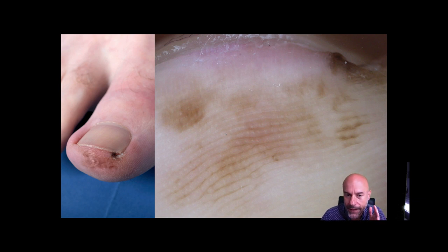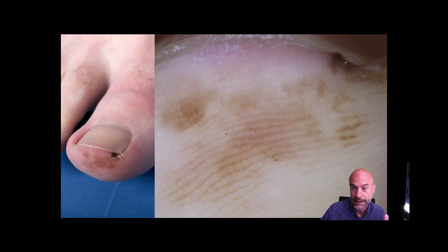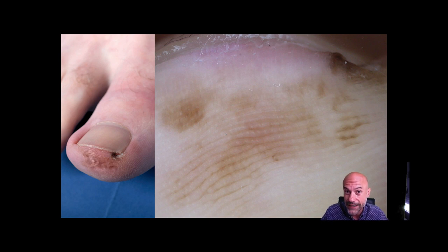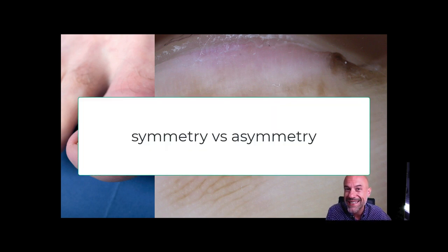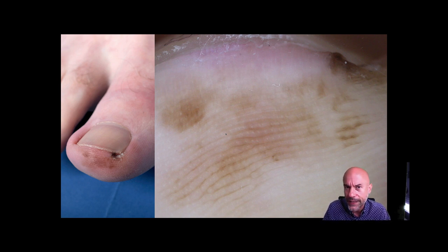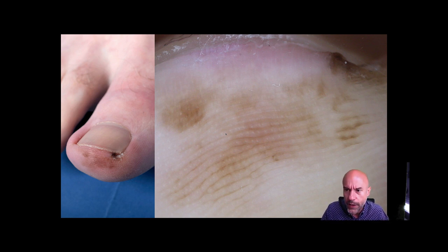One more thing concerning acral lesions: of course the main thing is to discriminate between furrows and ridges, but there is also an additional thing we should never forget — the basic rule of morphology of skin tumors. Benign tumors are usually symmetric and harmonic; malignant tumors are the opposite, usually chaotic or asymmetric. We should not forget this for acral moles. The question furrows or ridges is very important, but the question symmetry or asymmetry also remains important.